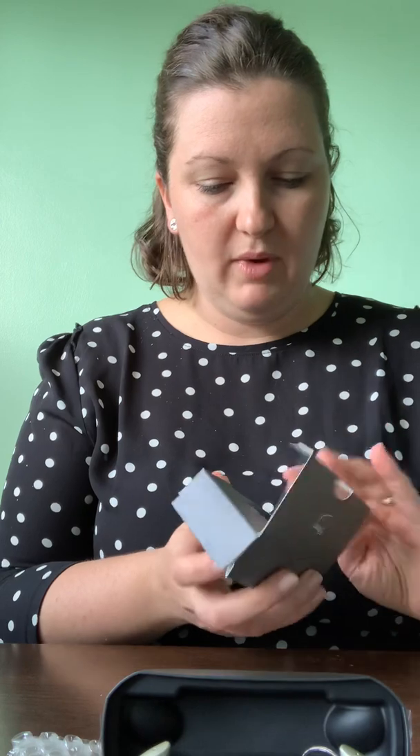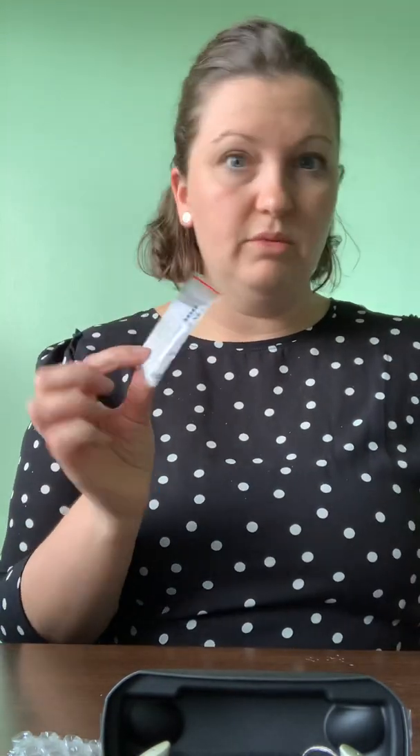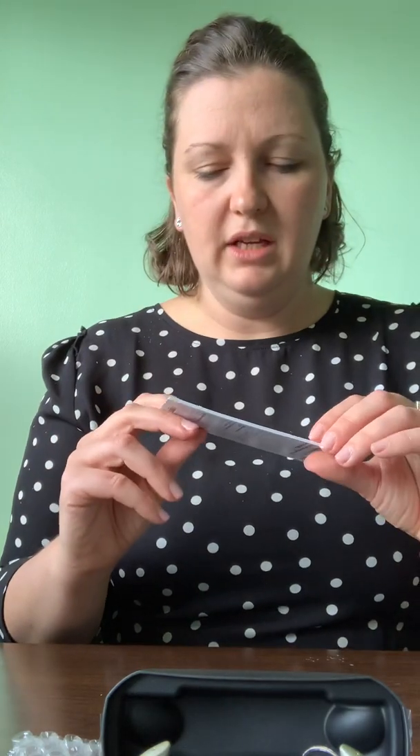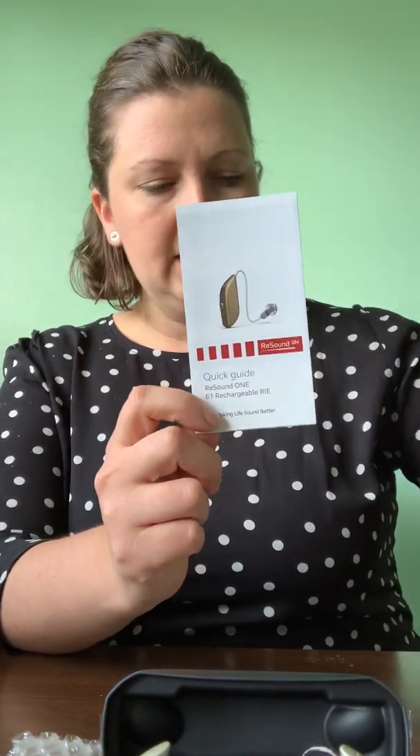The devices also come with a couple more receivers and include the cleaning tools, or what we call the first aid kit. We'll add some little color marker dots to show you where right is from left. There's a quick guide that's specific to these devices, and then of course the big user guide and the connectivity guide.